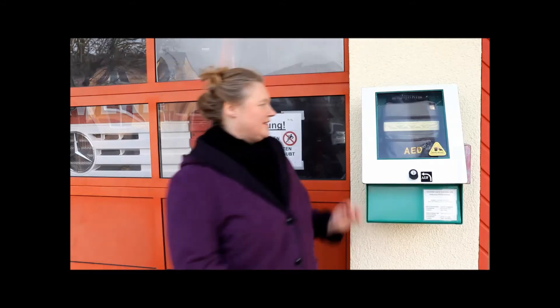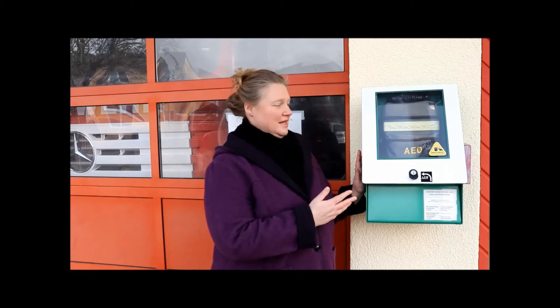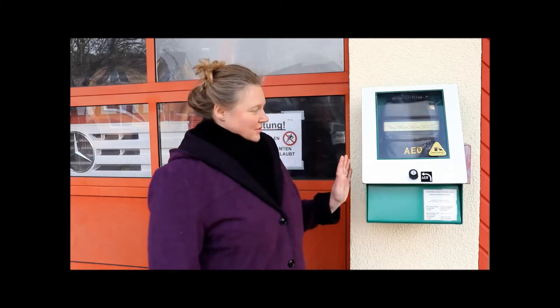Hallo alle miteinander. Heute wende ich mich an euch mit einem echt lebenswichtigen Thema. Sicher habt ihr alle schon einmal diese Geräte im öffentlichen Raum gesehen. Hierbei handelt es sich um AEDs, Defibrillatoren.